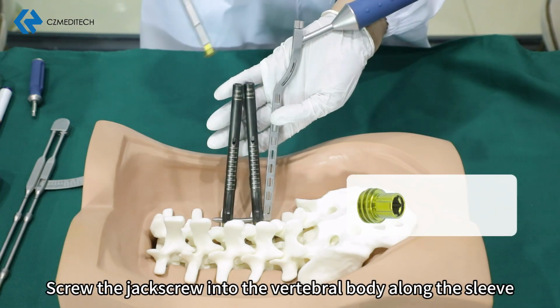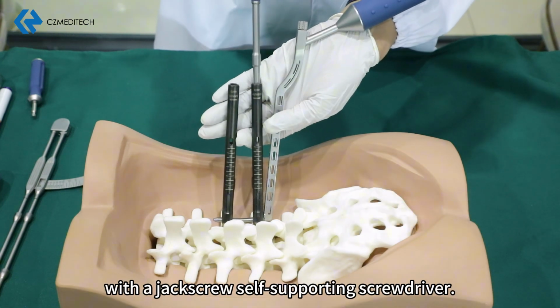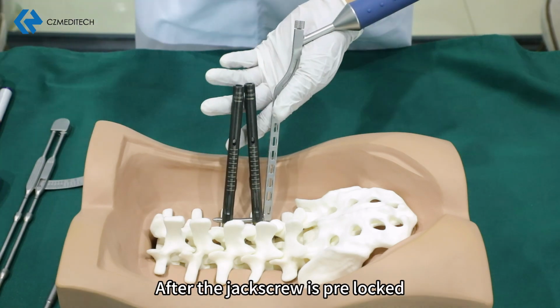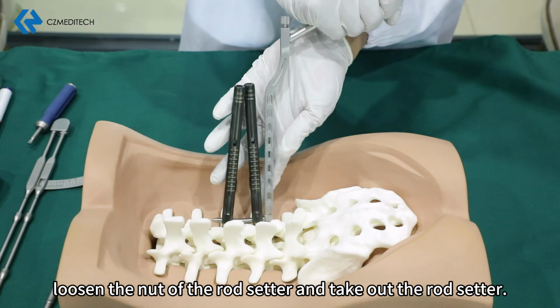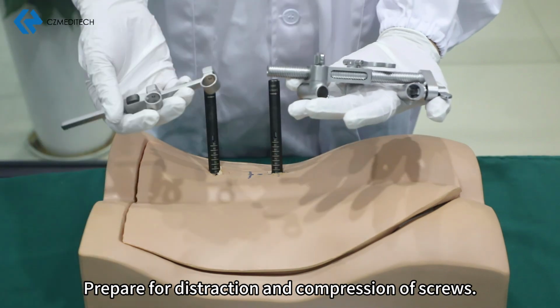Screw the jack screw into the vertebral body along the sleeve with a jack screw self-supporting screwdriver. Use a pre-tightening screwdriver to pre-lock the jack screw. After the jack screw is pre-locked, loosen the nut of the rod setter and take out the rod setter. Prepare for distraction and compression of screws.